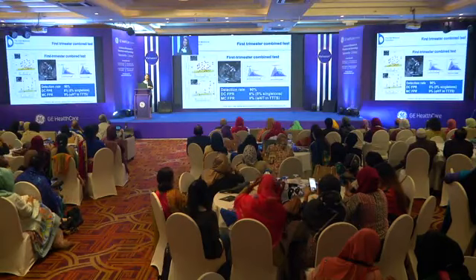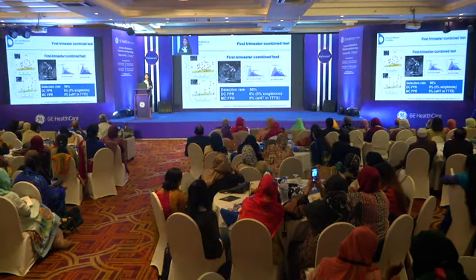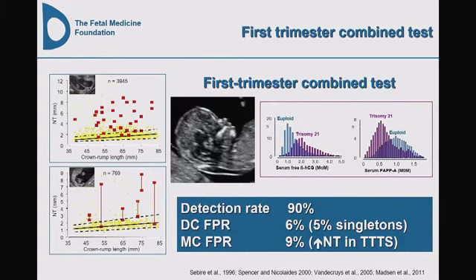And the answer is yes. But are there any differences between the different types of twins? And the answer is yes. When we are scanning dichorionic twins, remember those are non-identical, which means one baby could be normal and the other one could be affected with trisomy.